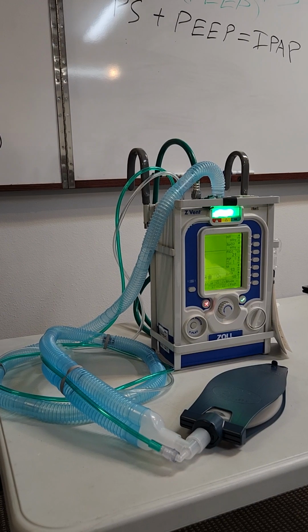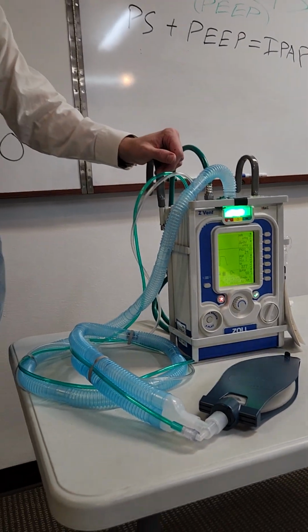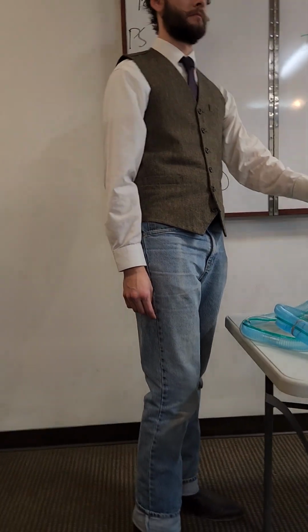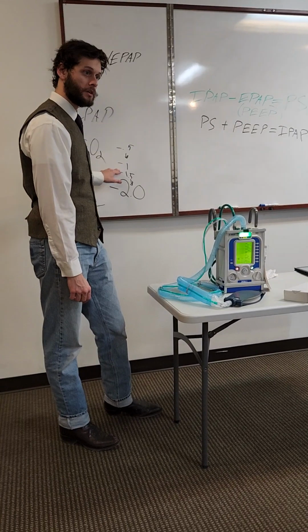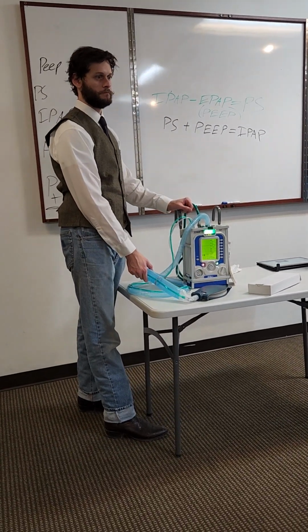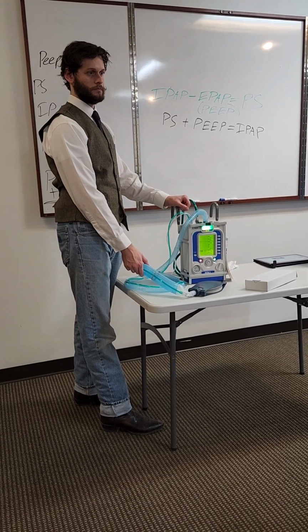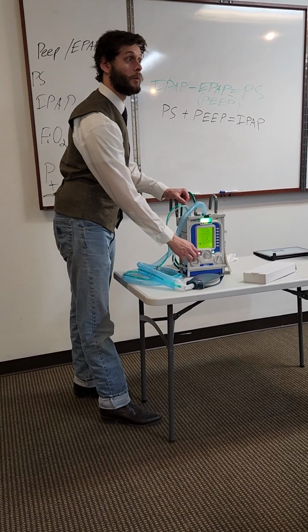Is that a setting that the hospital staff is going to tell you you're going to need, or is that something you're going to have to find on your own? Something you find on your own. Like I said, you just start at 0.5 and you can go to 1, then 1.5. So you're putting the patient on the vent and seeing at what point they can draw a breath? Yes. Drop it down to the bottom one, and then you can try walking it up.